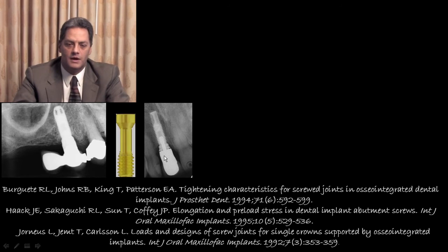In this particular situation, we have a semi-rigid connection, and there was intrusion of the natural tooth. We also have a cantilever effect. Is this the way we should have planned the restoration in the first place? My suggestion is no, as I do not like to see distal cantilevers. In this situation, the restoration was cemented and it was not properly seating.